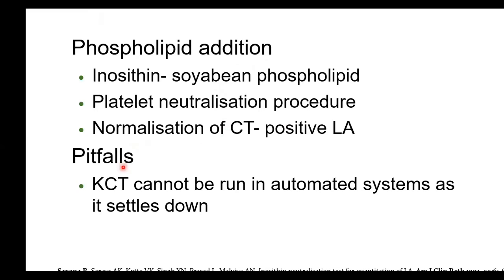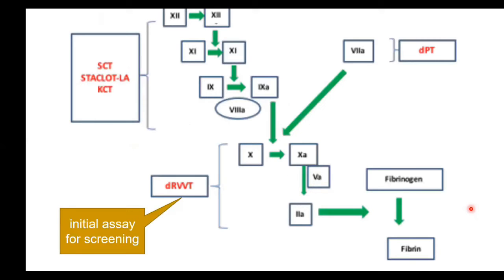The pitfall of KCT amongst all these tests is that it is difficult to be automated because it has particulate kaolin which settles and doesn't form a uniform suspension. So mostly for reliable results, we do it manually.